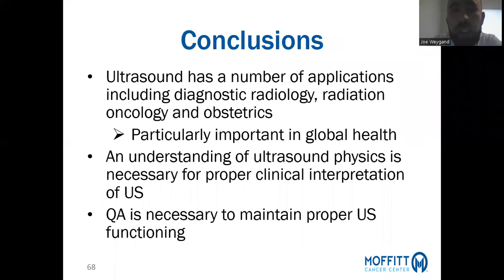Just to conclude, ultrasound has a number of applications, including diagnostic radiology, radiation oncology, and obstetrics. It's particularly important in global health, mainly because of its very low cost and also its versatility and mobility. An understanding of the physics of ultrasound is necessary for proper clinical interpretation of ultrasound images, and a quality assurance program is necessary to maintain proper ultrasound function.